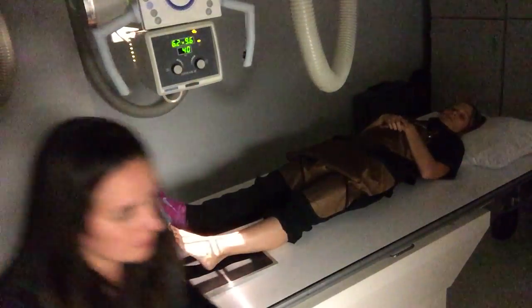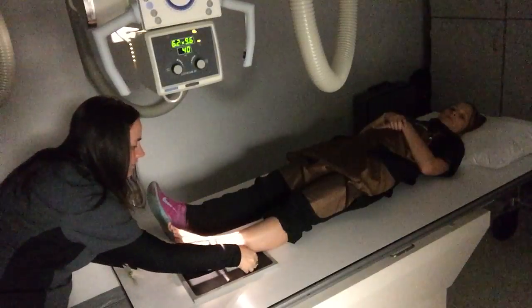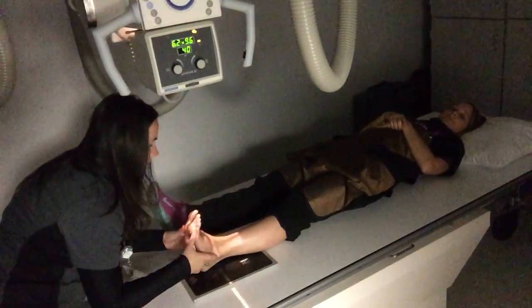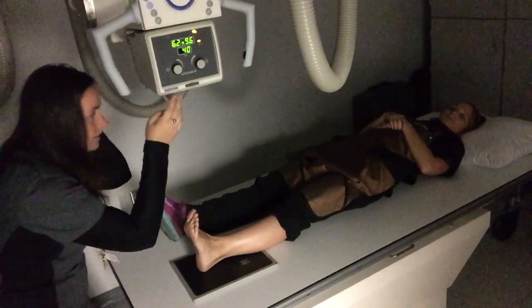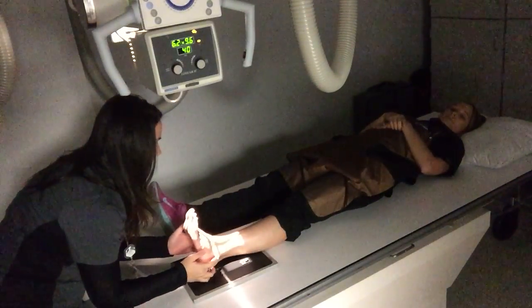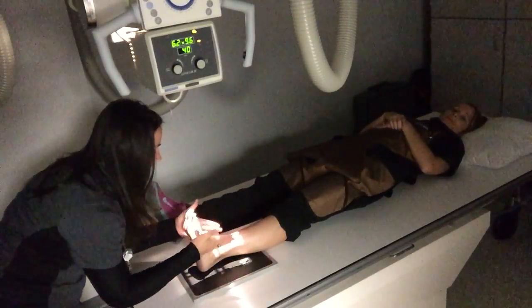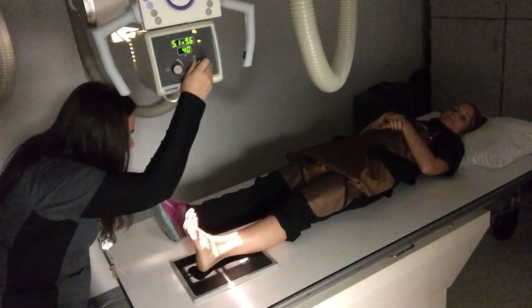And I'm going to grab my left marker here. I'm going to mark on the lateral aspect of her leg. Now I'm going to have her pull her toes back towards her to dorsiflex her foot. I want those toes pointing straight up vertically for this. And where I'm centering, I'm looking at her lateral malleolus and her medial malleolus, and I'm going right in the middle, so essentially straight down their leg. And then we're going to collimate nice and close.